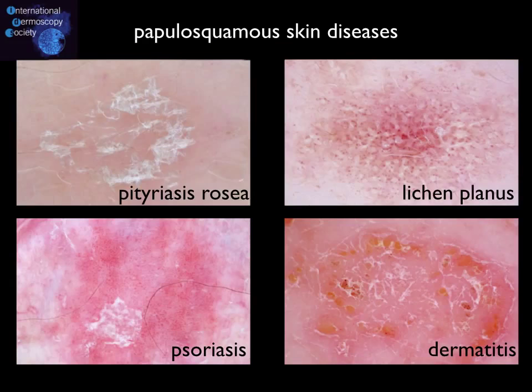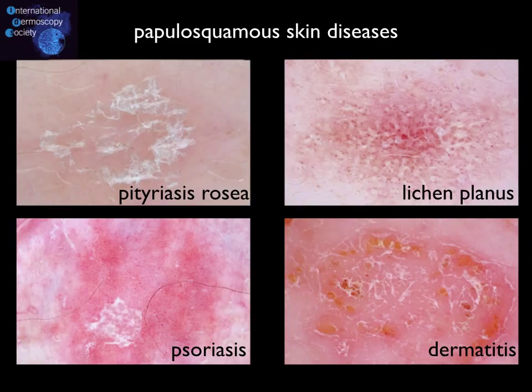Going back to the image we saw before, all four common inflammatory erythematosquamous diseases display dotted vessels. However, only in psoriasis is the arrangement of vessels so homogenous, so symmetric, so regular all over the surface of the lesion — and in this example, this is the most crucial dermoscopic criterion.